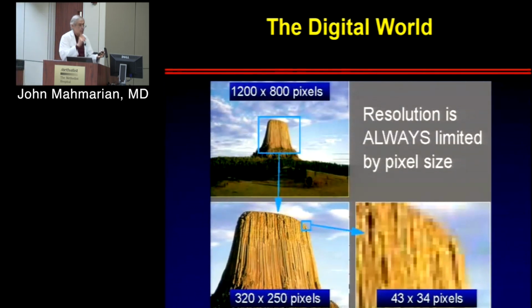Okay, so pixel size does also matter, and so we use a 64 by 64 matrix in nuclear cardiology. Obviously in CT we use 512 by 512, which is somewhat optimal, it gives us 0.5 millimeter pixel sizes. Obviously we're not trying to achieve 0.5 millimeter pixel sizes in nuclear, so our matrix is standard 64 by 64. But it shows you how pixel size can dramatically affect your image resolution for whatever spatial resolution you may have, okay?